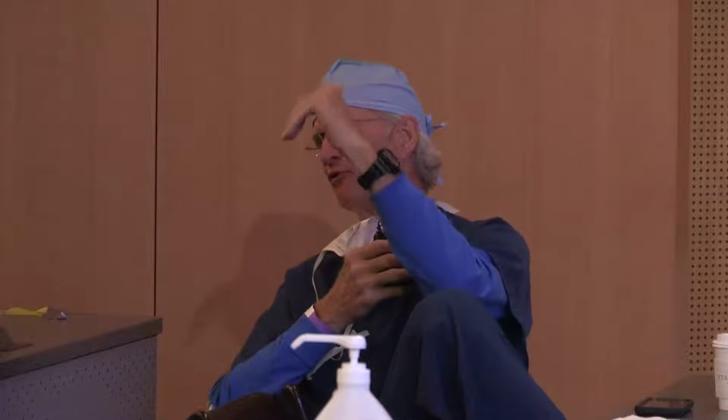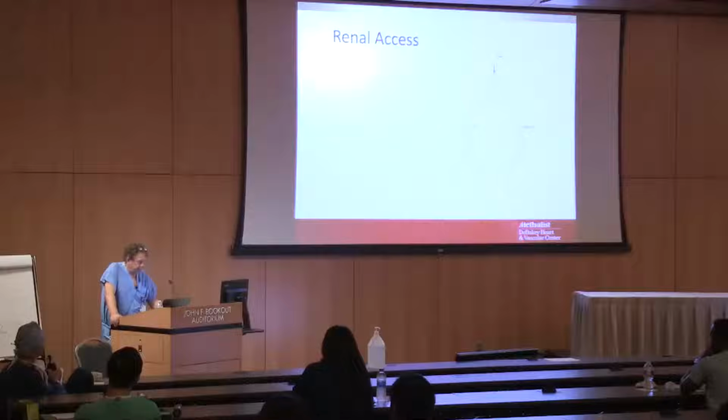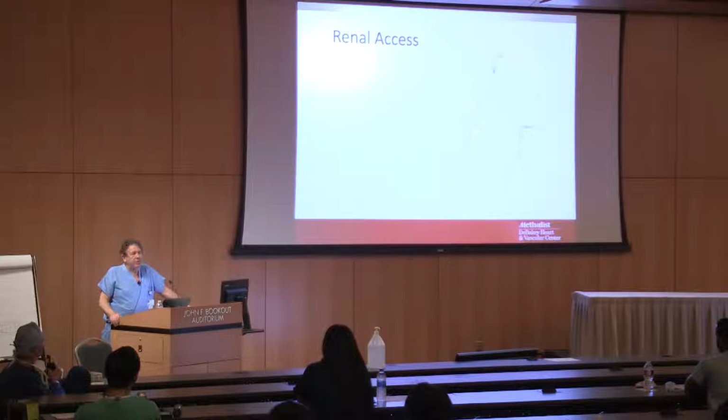Whereas where you're working, for instance, you can do it at the aortic bifurcation. You could take a wire up and over the bifurcation, form a reverse curve catheter, and then slide it up the aorta. Or using the subclavian is pretty safe because you've only put the left vert in vulnerability. But doing it across the arch is another trick entirely. Yeah, but knowing what these are is important because they don't always work, and sometimes you need the options of how you're actually going to do this.